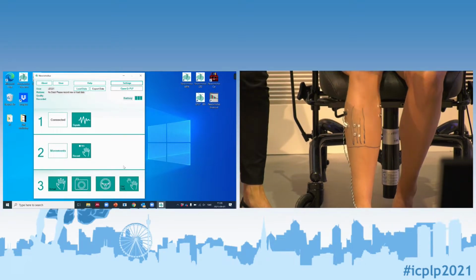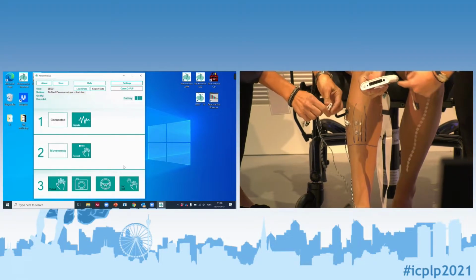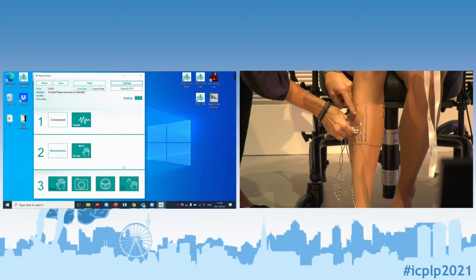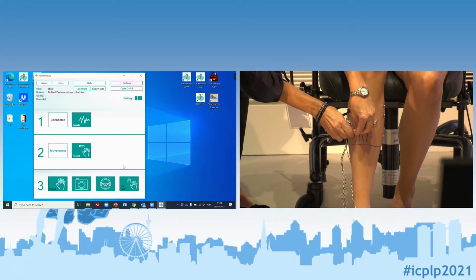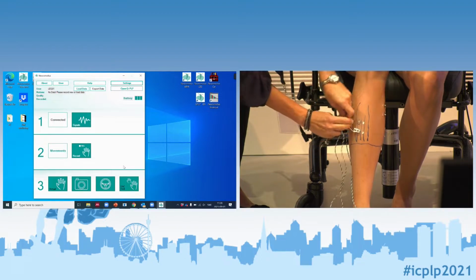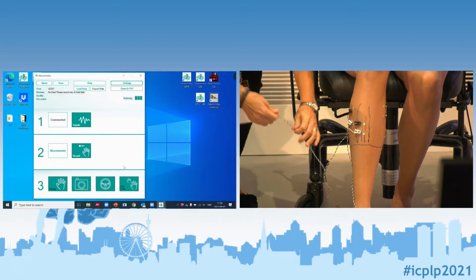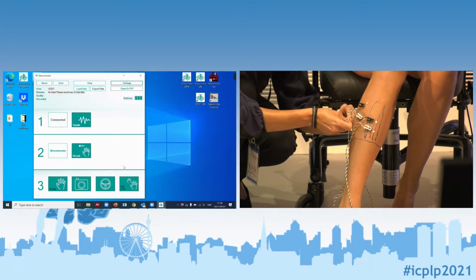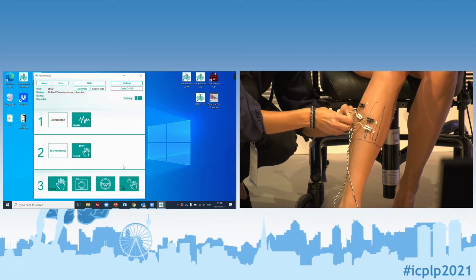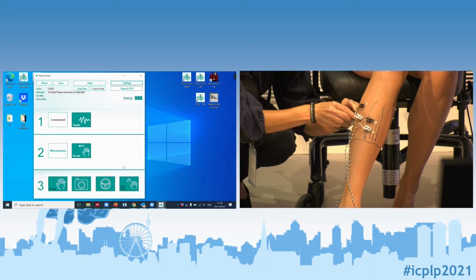Not the device. Well, in the device, you will see it here. You have certain channels that you must follow to then record the different activities. Important as well, because we have 2 channels of electrodes, 2 electrodes per channel, these 2 electrodes cannot be too distal between each other, because then we are going to read different signals. So ideally, we need to have like 2 centimeters or 1 finger in between these 2 electrodes.